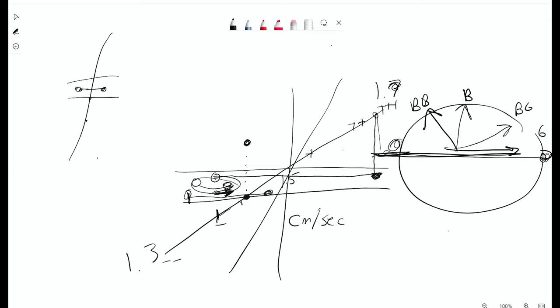If I'm doing my vessel wall, to really be able to see my vessel wall, which is very, very thin, I would need really, really tiny voxels. Right. And whenever you have two tissues in the same voxel, it's going to average out. That's right, partial voluming. And so let's just say we're doing the super macro, and this is what we've got.